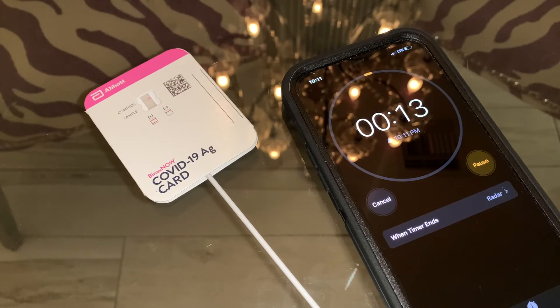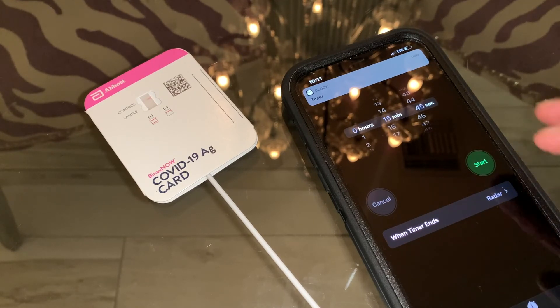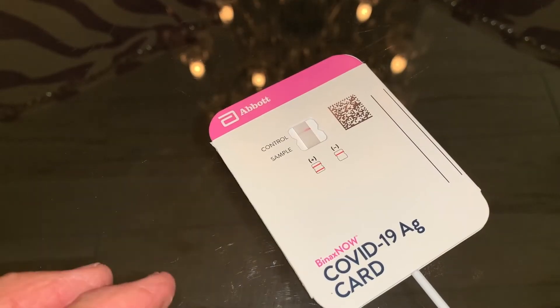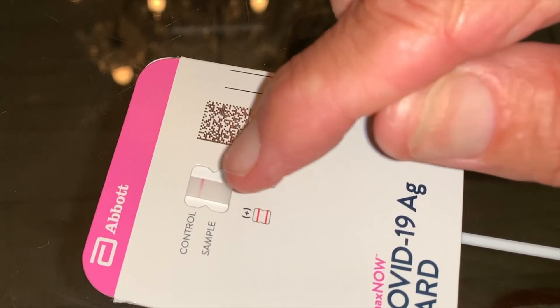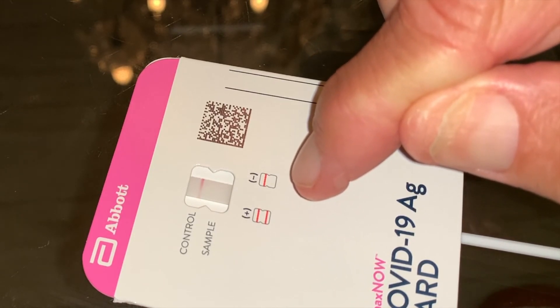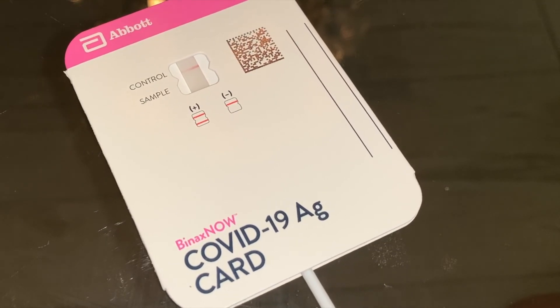We're coming down to the countdown — 15 seconds left — and we'll be able to look and see if we have COVID or not. Timer's done. Now we can take our card and look in the window. It appears there is no bar underneath, not even a faint line, and we do have our purple line up top. If you have two lines, you're positive; if you have just one line, you're negative. According to this test, Lynette is negative for COVID. Thank God.